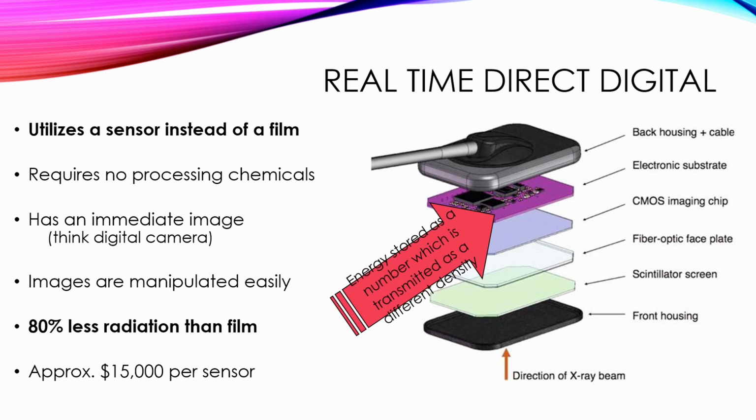In digital imaging, the contrast is the differences in shades of gray. It depends on what is called the bit depth, or the possible shades of gray that an image can store. For example, 1-bit images only allow 2 values of gray to be stored. 8-bit images allow 256 possible shades of gray values. A 12-bit image allows 4,096 different shades of gray that can be stored there. I didn't ever realize how many shades of gray there actually are. It has a lot of ability to create a more contrasted and detailed image.